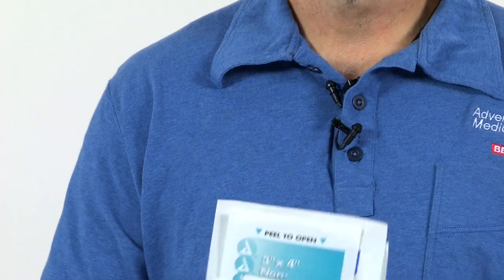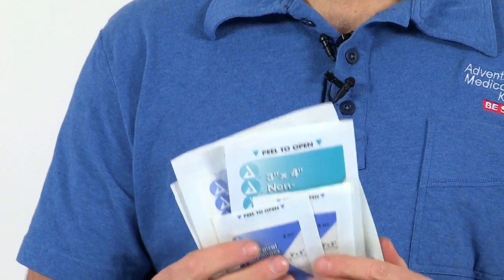Inside the kit you will find quality AMK supplies including butterfly closure strips to close wound edges, sterile bandages and dressings, antibiotic ointment, and antiseptic towelettes to help prevent infection.